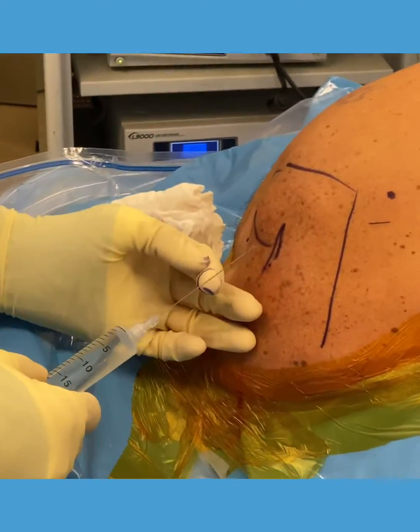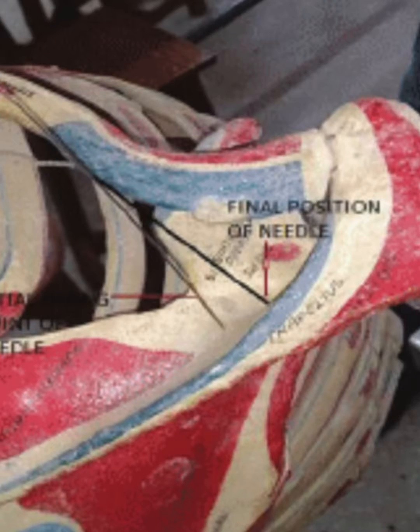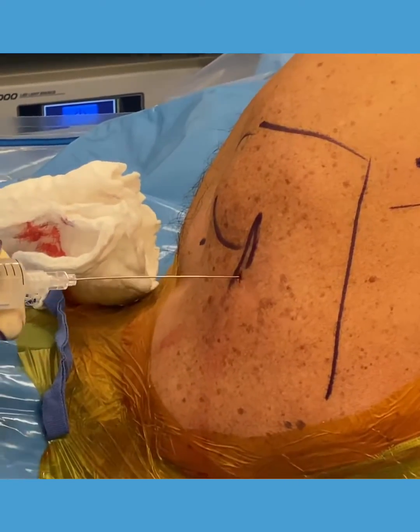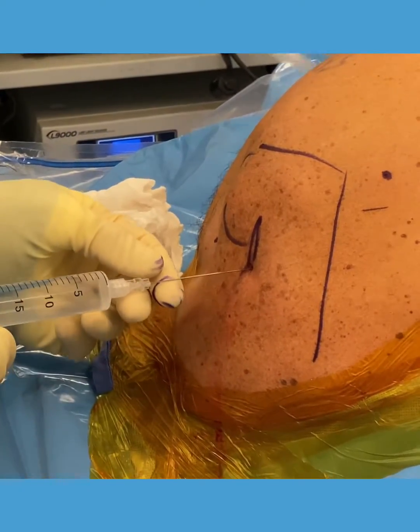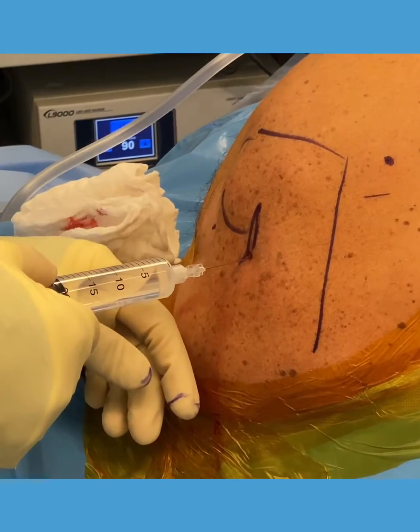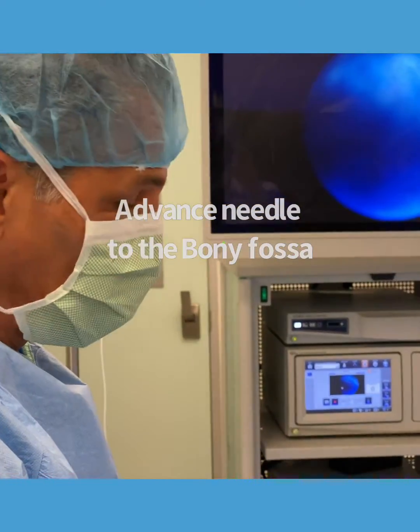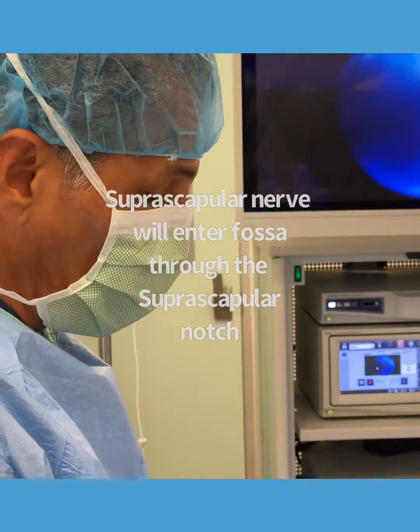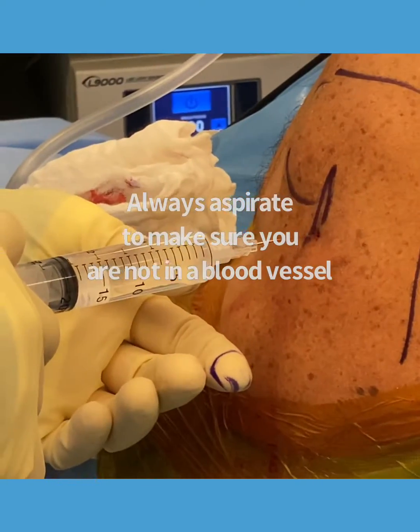So what I'm going to do is a suprascapular nerve block. I place a 22 gauge needle straight down, but slightly on an angle, about the level of the coracoid. I take it down until I hit the fossa — and that fossa is the supraspinatus fossa. That's where the suprascapular nerve lies on top of the bone. So I aspirate and inject. And this is the suprascapular nerve block.